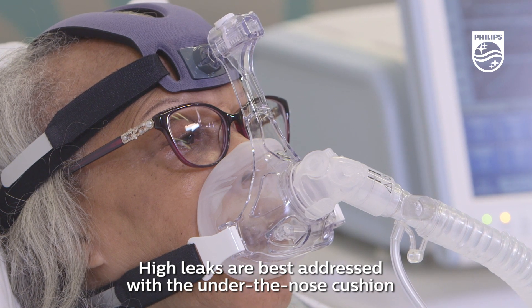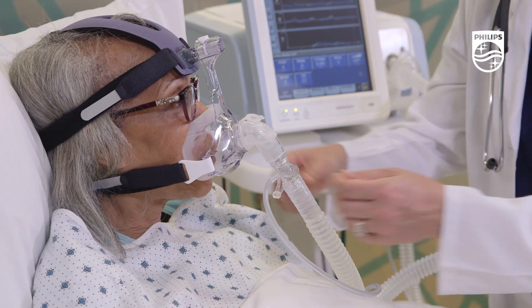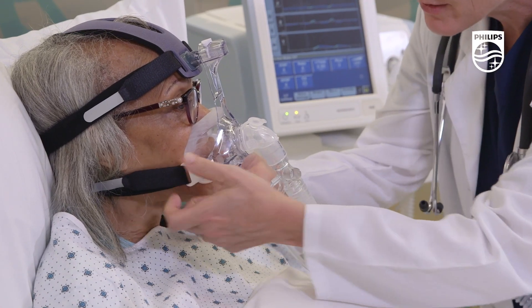If leaks are seemingly unmanageable through angle or tension adjustment, the mask should be reassessed or resized.